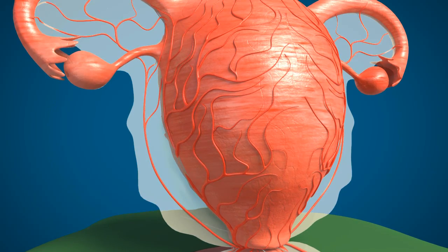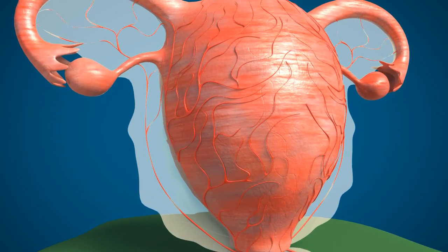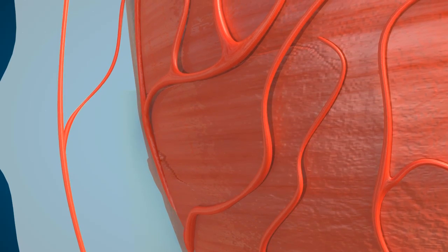This will occlude all the blood supply to the uterus, including the ovarian vessels, uterine artery and its branches. You can see the uterus becoming pale and the vessels getting shrunken.